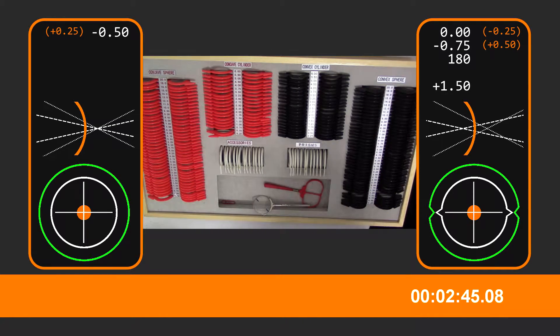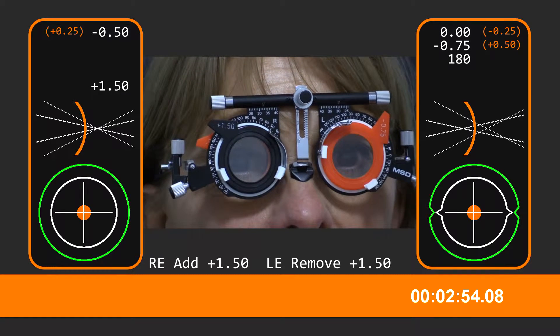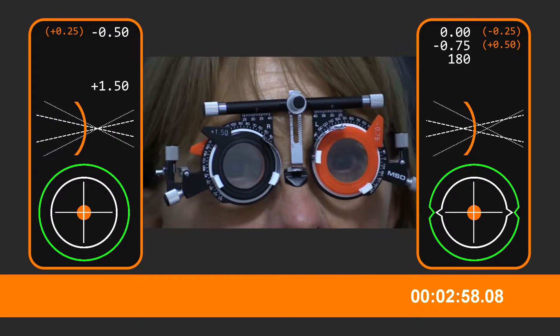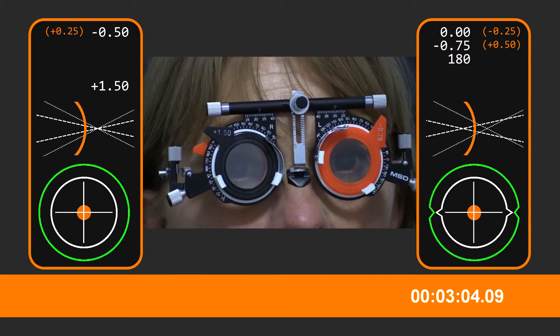Do you like that handy little switch there? For what? For the light! Oh yes, for the light — that's very nice, actually. Nice little addition, that is, because you didn't know that when you started off. No, no. Now let's just — oh yeah, that's right — have a look at those ones there.